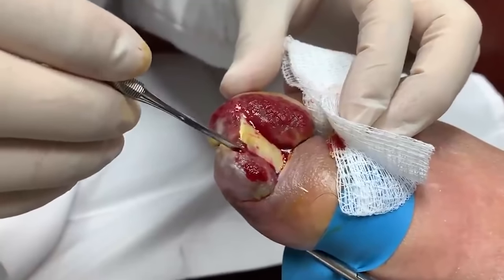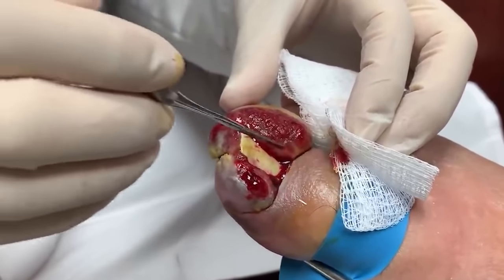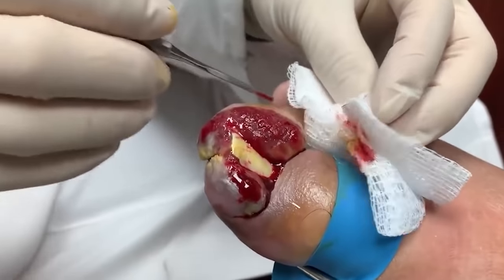This nail is irritating the skin and then your skin is trying to protect itself and forming a very large granuloma — almost looks like an extra toe.